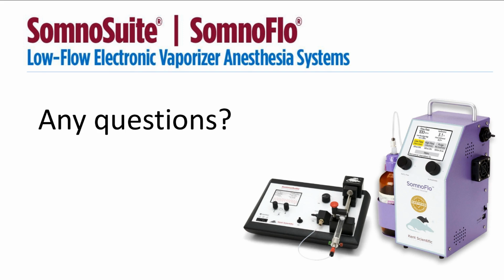Can we use both O2 and N2O gas mixture? Off the top of my head, I know that it has been done. There is a little more tweaking that we'll have to do with the systems. That is something we'll have to talk to you about in more detail at another time, outside of this workshop, so we can discuss your study exactly and get to know what you're trying to do, so we can help you create that type of gas controller for mixed gas supply.